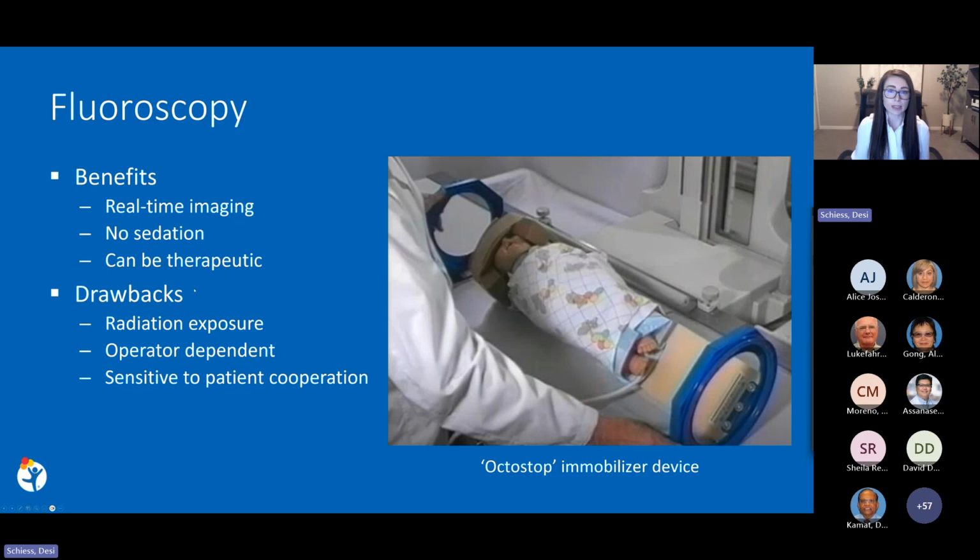Fluoroscopic images are usually taken by a radiology provider, with a technologist assisting with patient positioning and contrast administration. Fluoroscopy uses intermittent, continuous low-dose X-rays to produce dynamic images, allowing for real-time visualization. Fluoroscopy is almost always performed with contrast, which can be introduced through various routes such as oral, rectal, or intravesical. The contrast agent is then imaged as it passes through the anatomy of interest over time.